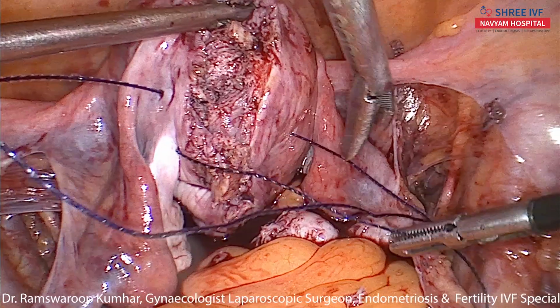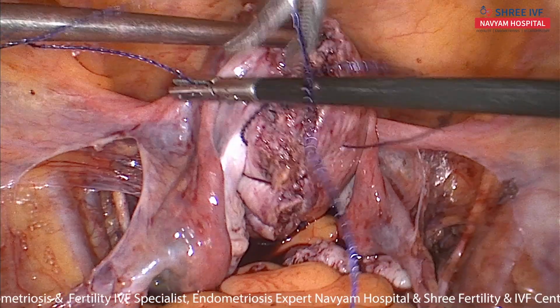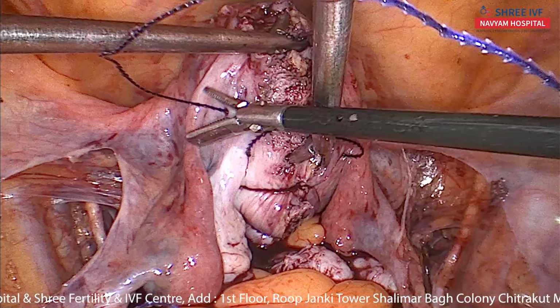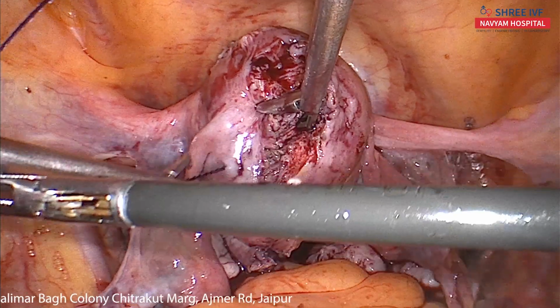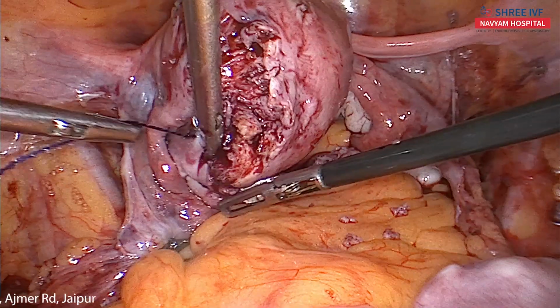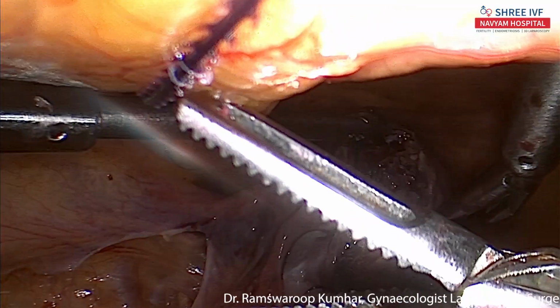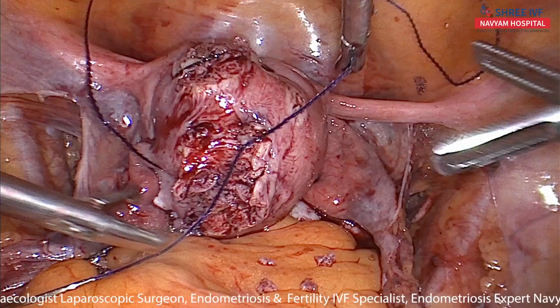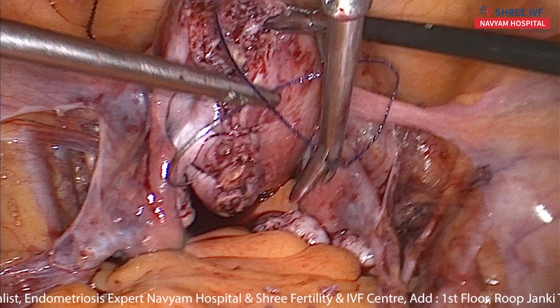It will take some knot, I think. Okay. One. Tighten it. Tighten it. Good. Almost. Not a good suturing in the posterior wall, but it's okay.